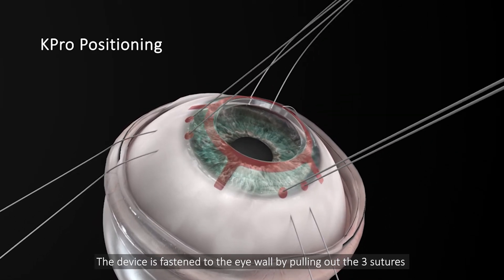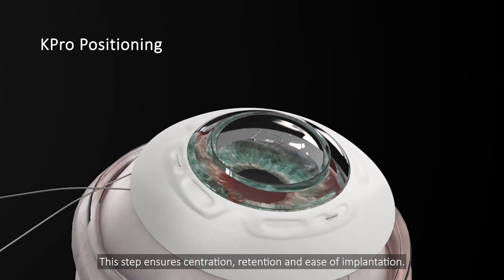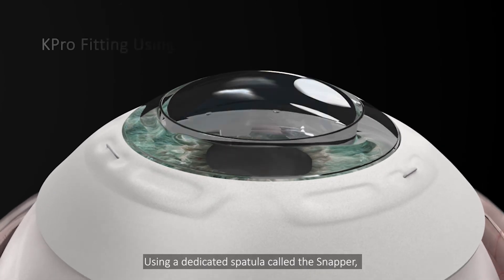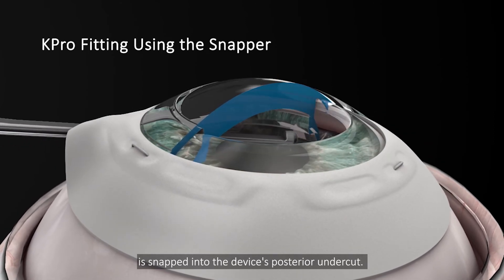The device is fastened to the eye wall by pulling out the three sutures, and then tying them up between the device skirt and the sclera. This step ensures centration, retention, and ease of implantation. Using a dedicated spatula called the snapper, the corneal rim, which is stained for ease of visualization, is snapped into the device's posterior undercut.